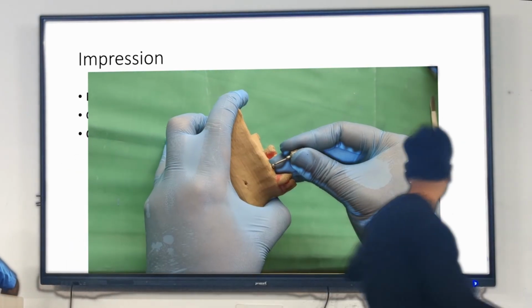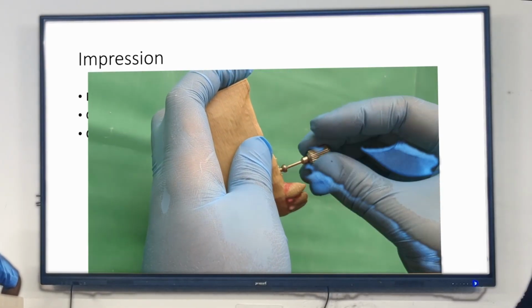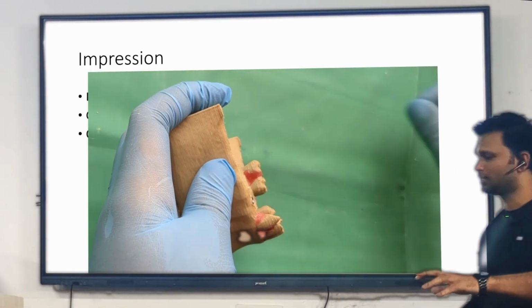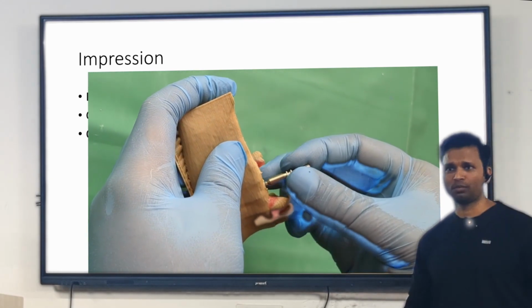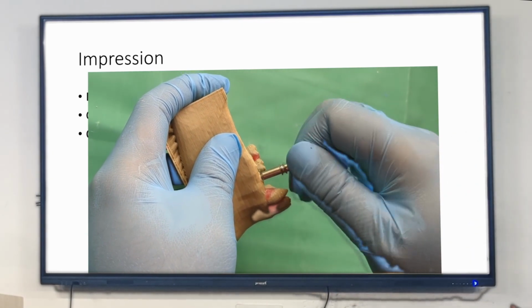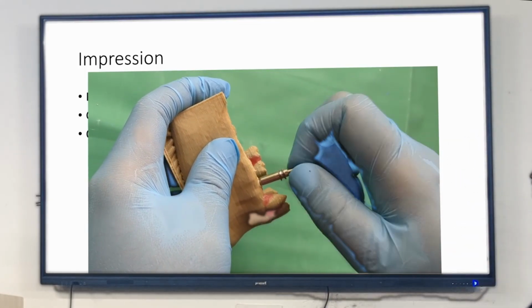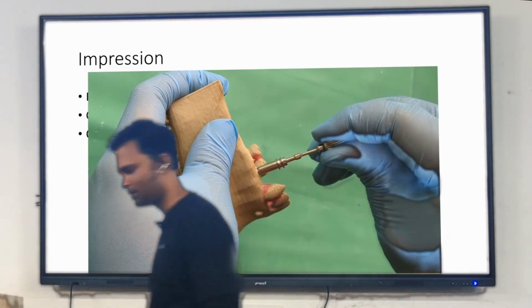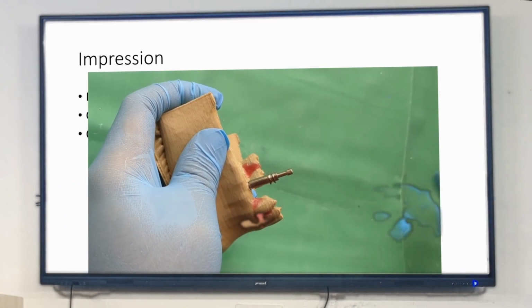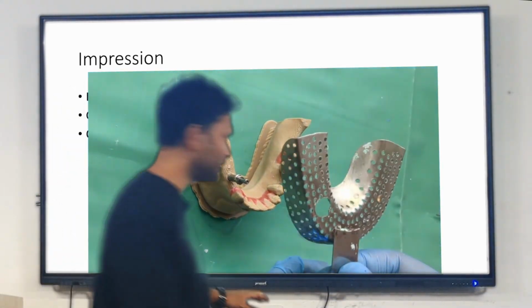So you remove the gingiva former. Five minutes left, we'll be quick. Then you attach the open tray impression post to the implant. Once you attach the open tray impression post to the implant, again tighten it with the hex driver. Then you're going to take the impression. Now, you can create a custom tray for the impression taking, which we'll show now.